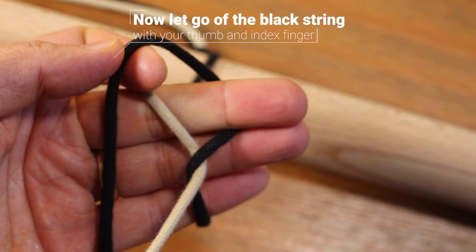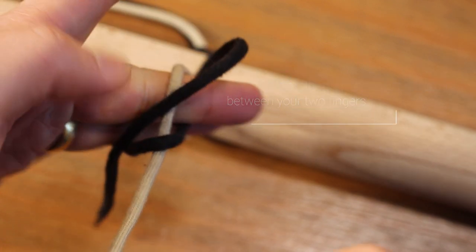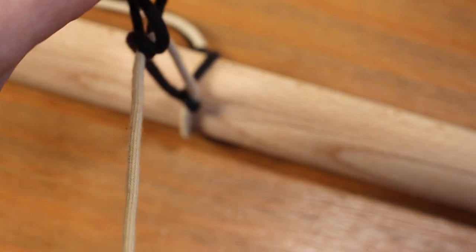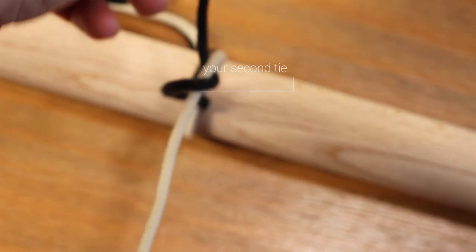Now you can let go with the pincer grip and hold on to the black string between your second and ring finger. Now pull the black string underneath the white string through the hole — again you can hold on to that black string with your thumb to get a better grip — and you've now completed your second tie.